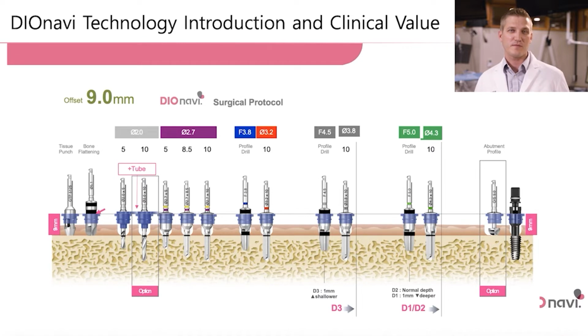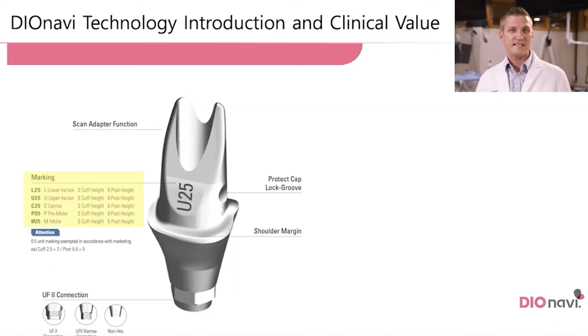Last thing I want to mention when we talk about this is this anatomical abutment. These anatomical abutments, again, are designed from analyzing hundreds and hundreds of custom abutments. And they came up with some unique geometries, and those geometries are very complementary to soft tissue contours in the mouth. So you don't need to pay the price for a big old custom abutment, but you still get the benefit of an anatomical abutment that can go in, be very thoughtfully crafted relative to the soft tissues, could theoretically stay in the mouth the entire time, never needing to be removed, because it also doubles as a scan body. So this can be scanned in the mouth, and then from that impression, a final prosthetic can be planned.